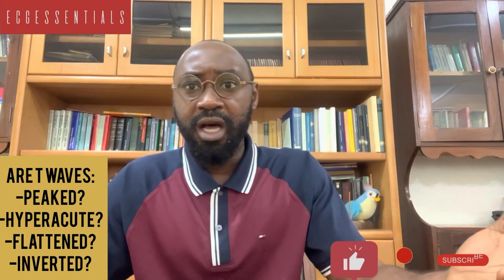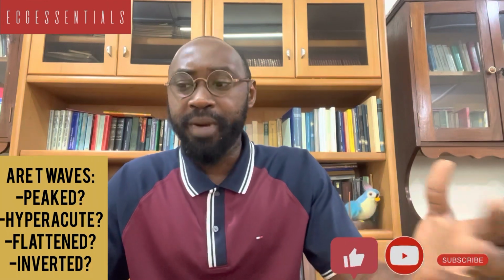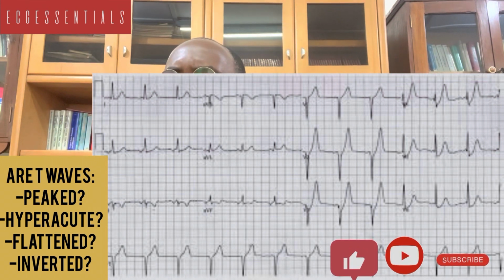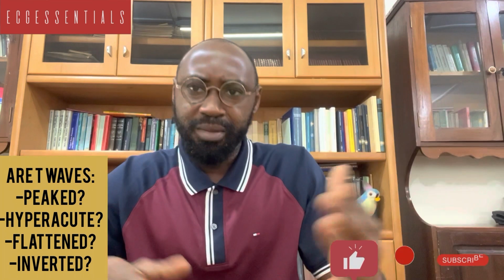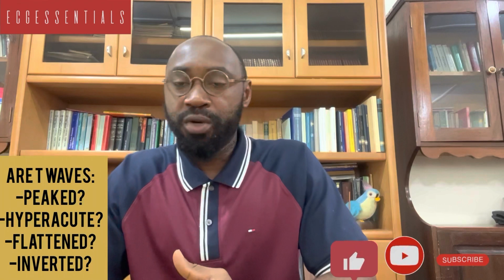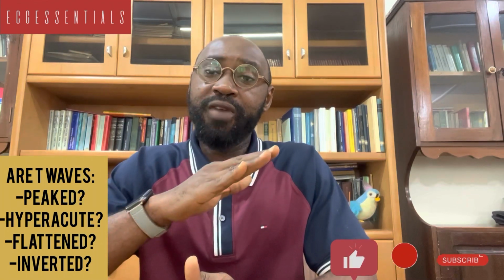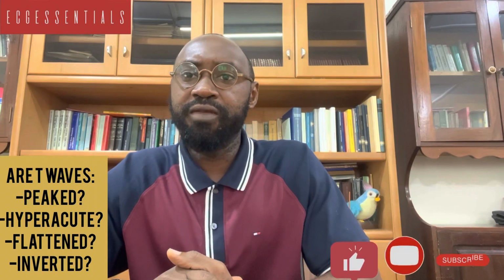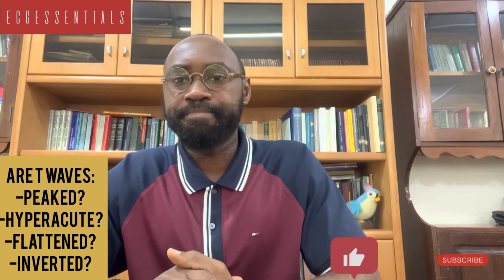The other abnormality is hyperacute T waves, which may be broader compared to the peaked T waves, and then more asymmetrical, sometimes symmetrical in terms of morphology, and it's important to try and identify these hyperacute T waves because it may be one of the earliest signs of STEMI, that is an ST elevation myocardial infarction.